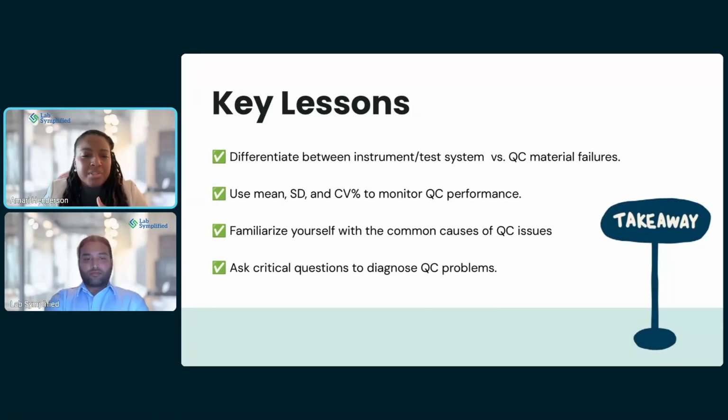I know we had a reference lab and surrounding labs that we sometimes borrowed things from, even if they don't have your same instrument, because the manufacturer of the QC will often have data for multiple platforms. So you could potentially ask them to run your controls. If you don't have any surrounding labs, call your manufacturer so they can maybe send you a new shipment of product, so that you can rule out instrument related issues another way, using other troubleshooting steps.